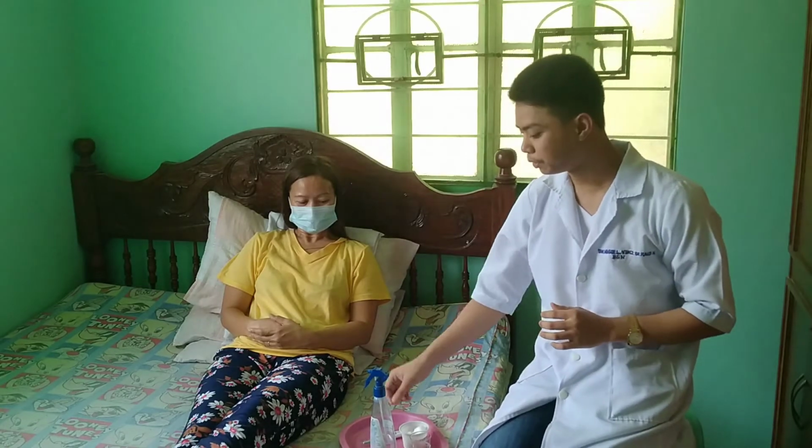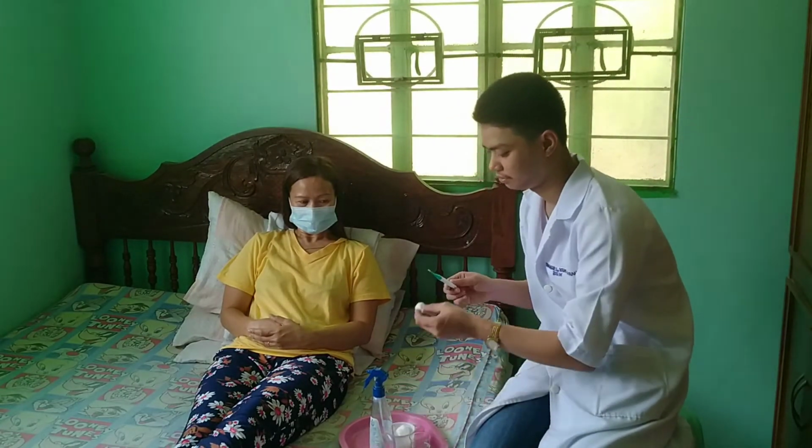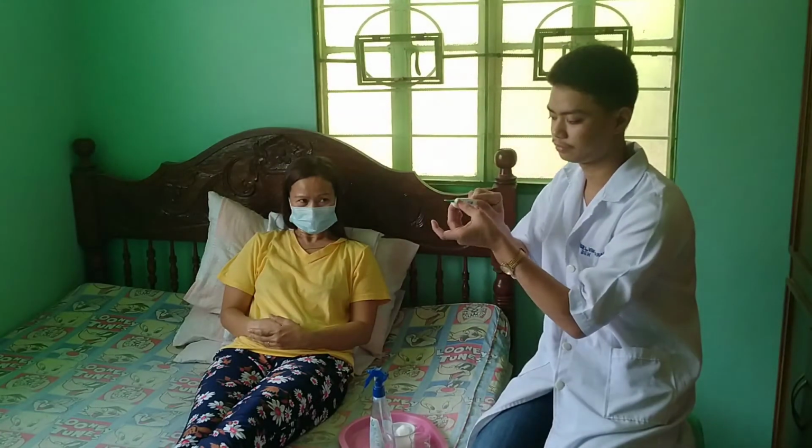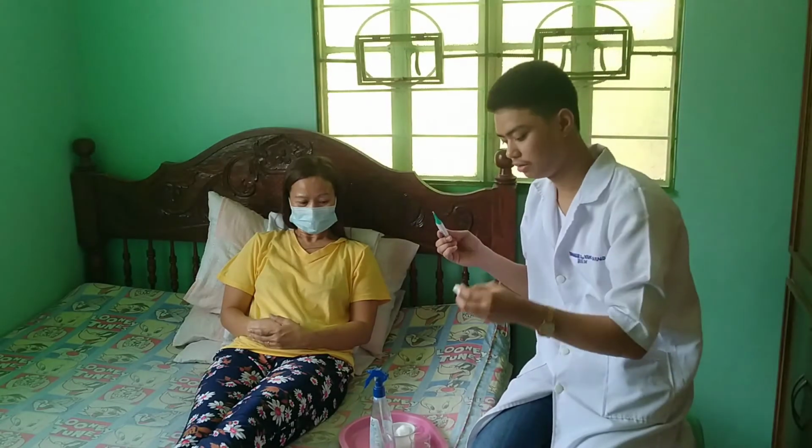Place your client in an appropriate position, but since the position of the client right now is comfortable to her, I didn't do that anymore. Next, clean the thermometer from tip to the body. And dispose of it. As a male student nurse, I will ask the client to put this thermometer on her axillary to prevent the discomfort that may be felt by the client.